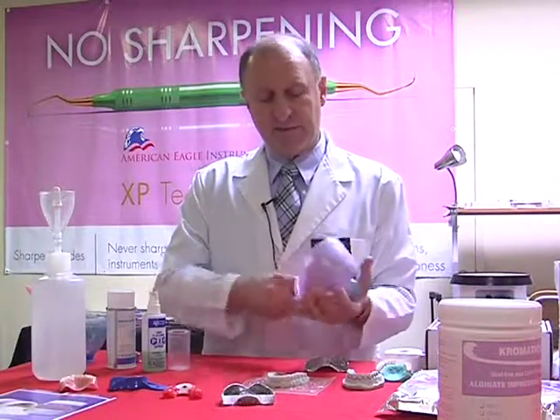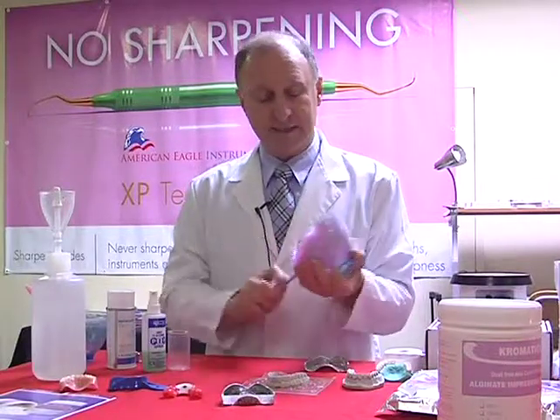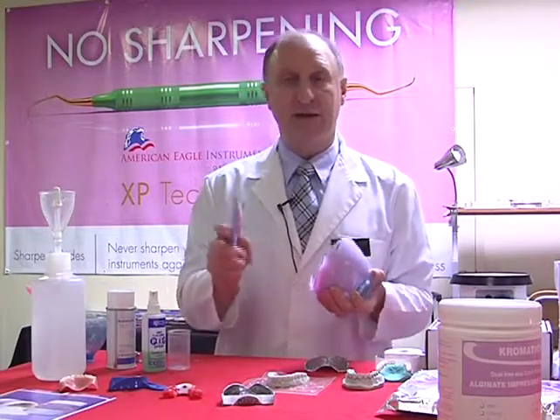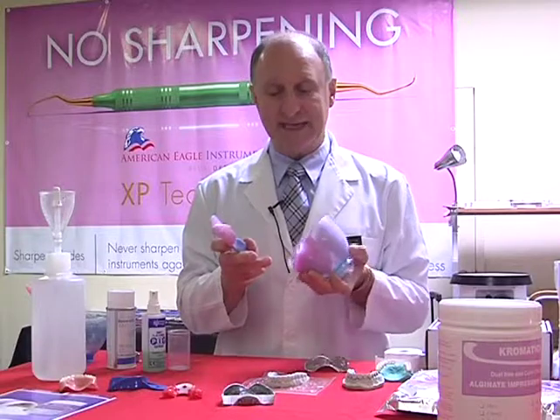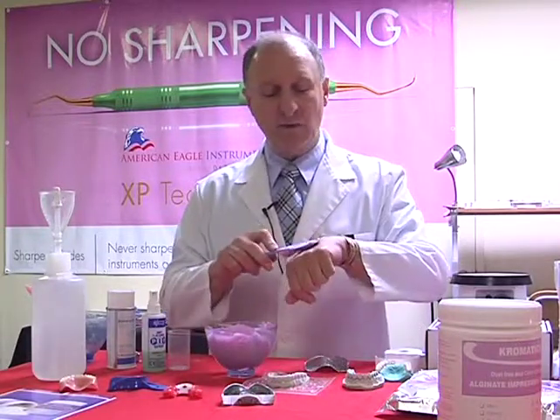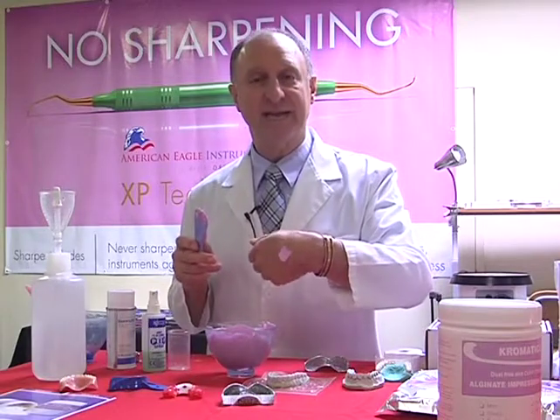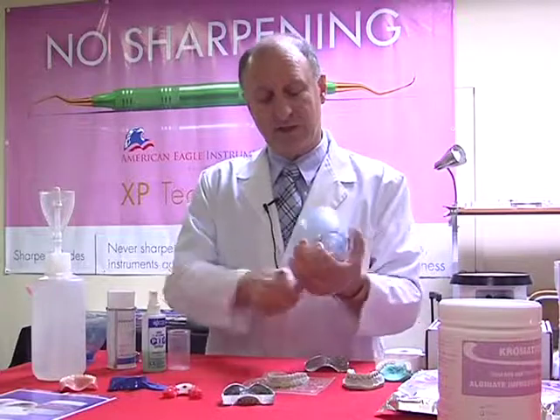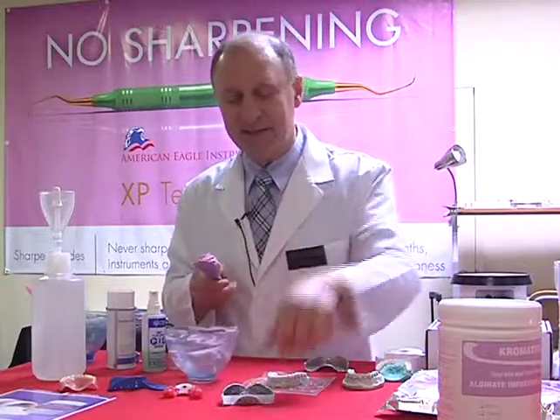Now, at this point, I've got our material that's mixed. I'm going to take a small amount of the material, and just to show you how we got a good mix of material, this is what we should be looking for. It's dense, it's thick, it stays on the spatula, it doesn't drip off. I normally take a small amount of the material on the back of the patient's hands and tell them to watch this whilst I'm going into the mouth to take the impression. So it's sort of, again, distracting them.